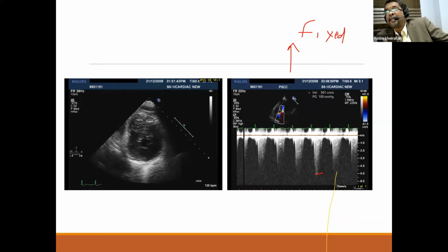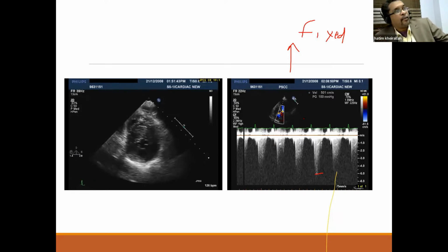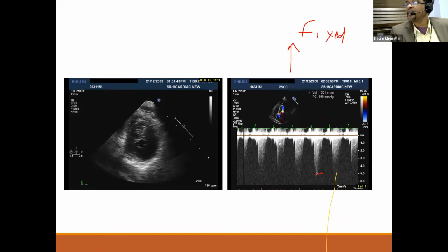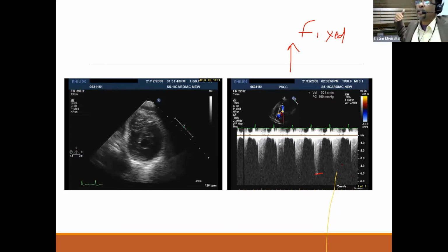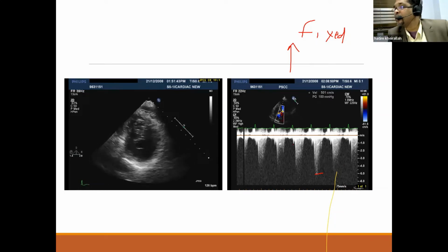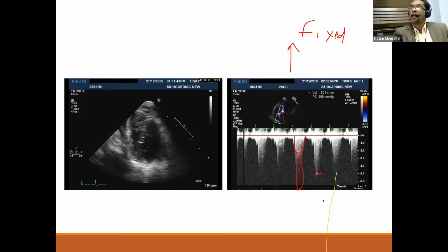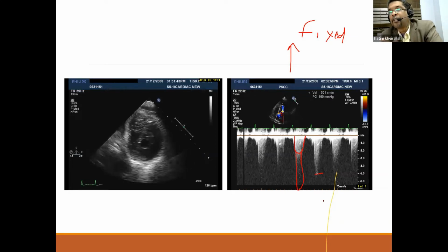Sometimes you move the signal a little bit towards the left atrium and you catch a tail of the mitral regurgitation, and that's gonna contaminate your signal. And we know the MR velocity is much higher than the aortic velocity, so instead of having a tracing that ends here, the contamination is gonna take you all the way down to higher velocities. So you have to make sure that you are tracing the right jet, okay, to avoid contamination.